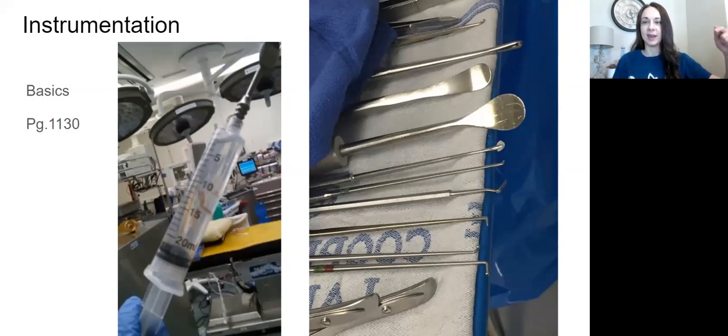So they can thread that blade through, put the handle on each end, and boom, the bone is cut. Just like that, super fast. So Gigli saw, just like the one we use to amputate legs, that's the same thing we can use to get the bone flap off if we have to, but we've got lots of better options.